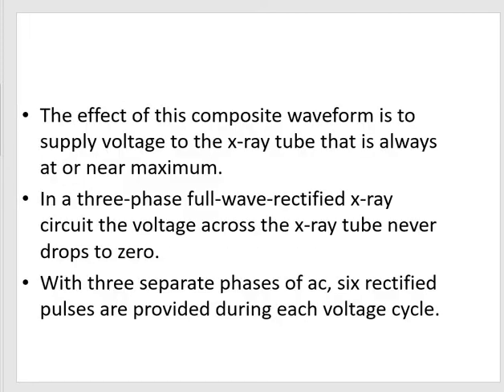Alternating current, or simply AC, is a type of electrical power in which the electric current changes over a period of time, both in magnitude and direction. AC can be delivered either as a single phase or a three-phase. So what does phase mean? An AC power system consists of two wires, the phase, sometimes called the line, and the neutral wire. So there are two wires. In a three-phase system, you can use up to 3 or 4 wires. No neutral wire is needed in this phase power.